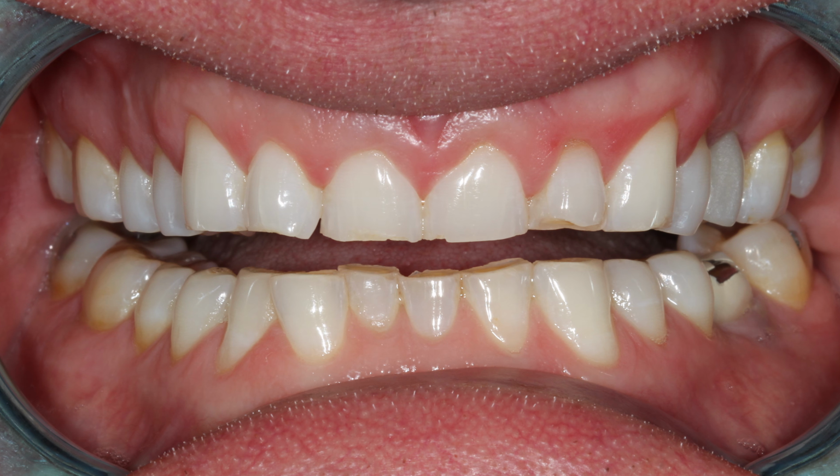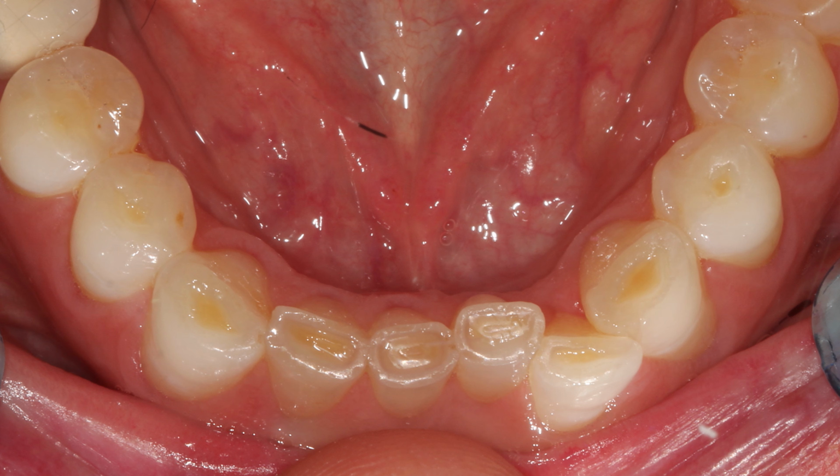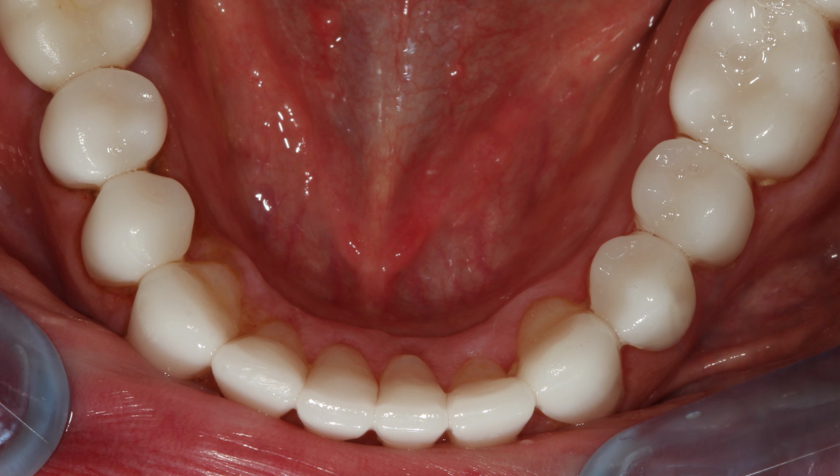This guy came to us with this issue of tooth wear, and he also had some misalignment. He's got this canine on his lower arch that is sticking out in front, so we've got an issue with its position. We really needed to use some alignment to get that right back in the right spot. We don't always have to do that, but for him, it was the best choice. So we decided to go ahead and move that tooth back in with some clear aligners. And then after we did that, we used some amazing technology to raise the teeth back up, create the proper dimension and height, and then give him a bite that looks good and functions well.